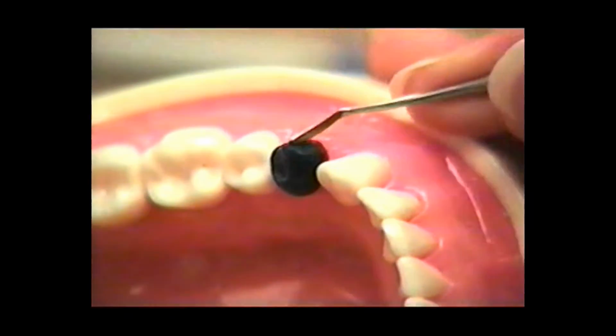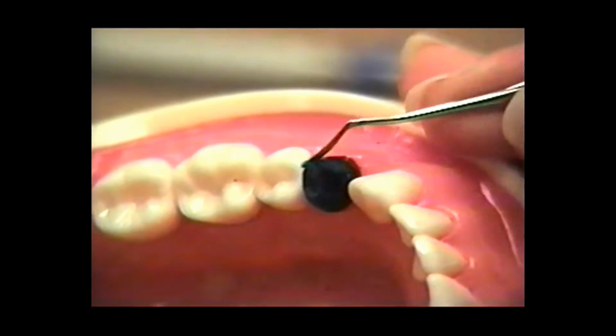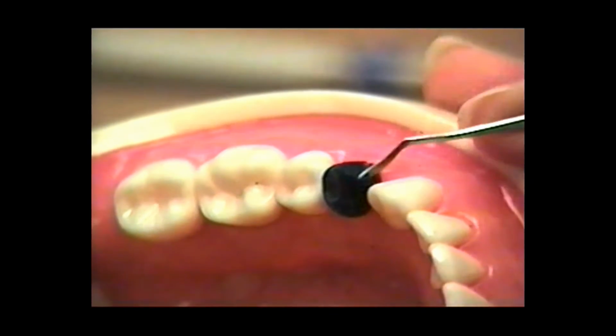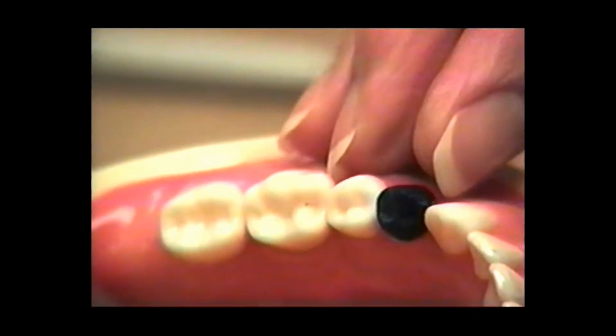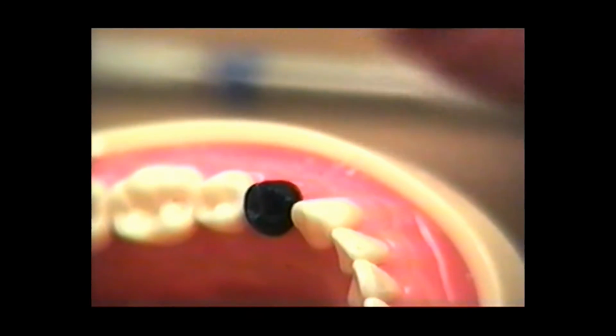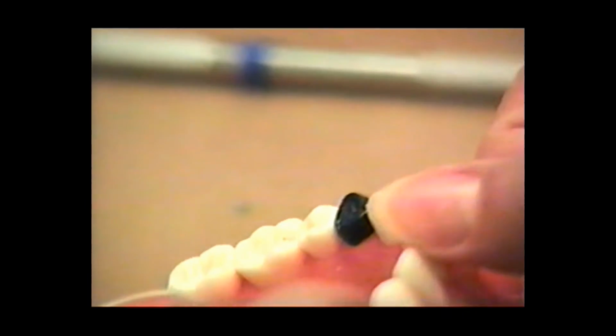and just very gently, in a rubbing kind of motion here. Just rub it. Don't try to take away a lot at a time, and that gives me a nice smooth facial surface. Then anytime I have little extra bits of wax on there, I clean them away, and that's really important, and I'll show you why that's so important as we carve the occlusal anatomy on this tooth.